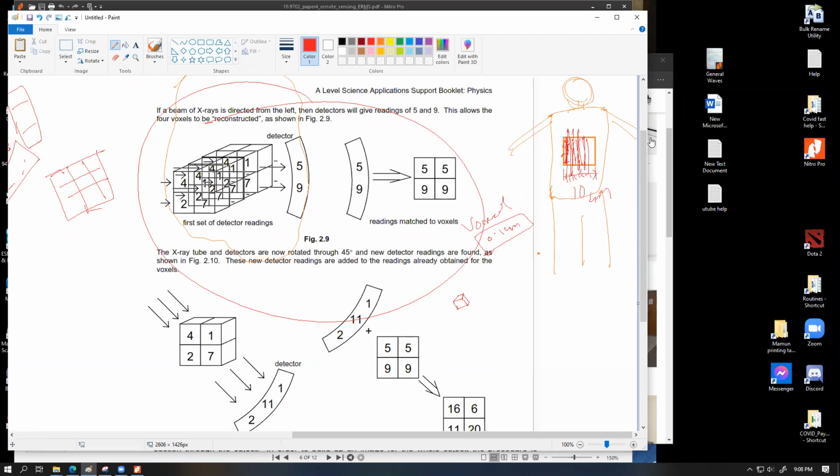No, there isn't. How many slices we actually have to scan depends upon two factors: how big a region you want to scan, and how small your voxel is. Because the smaller your voxel, the more precise the information, pretty much like an HD video. The smaller the voxel size, the pixel size, the crisper and more detailed the picture looks. Similarly, if the voxel size is small, your diagnosis data would be more precise and more pinpointed, but it will require a much bigger amount of calculation power or data handling power for the computer or the software that you are going to use.